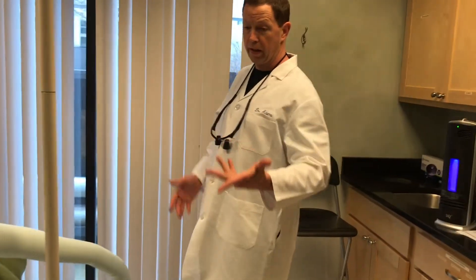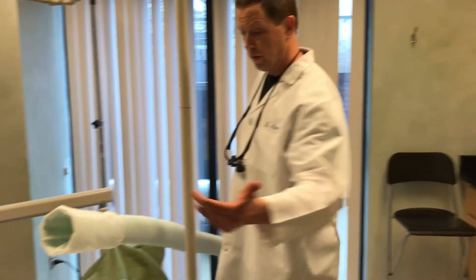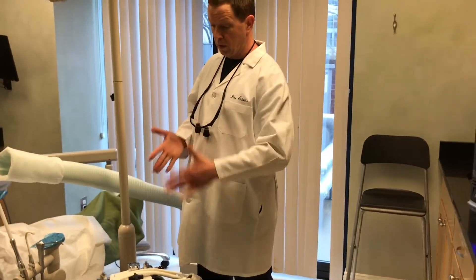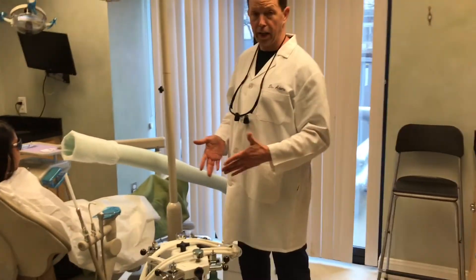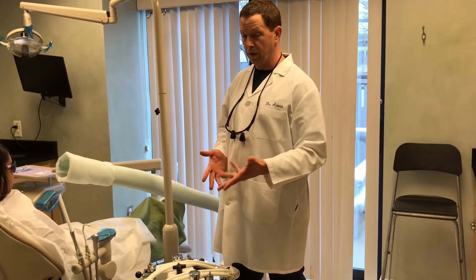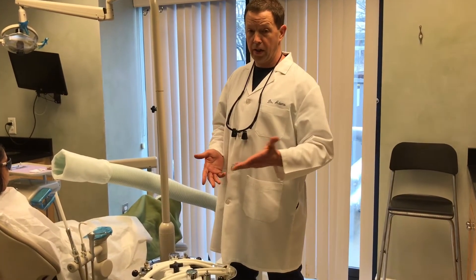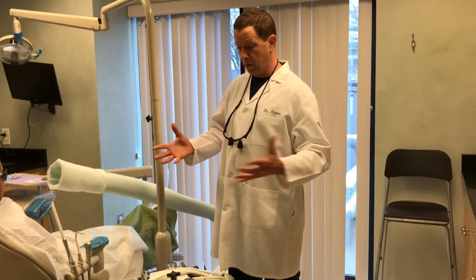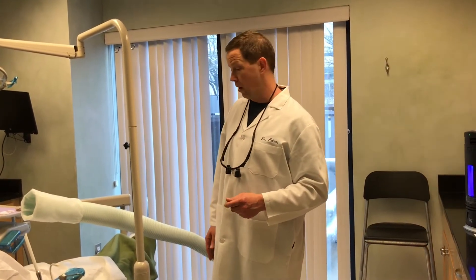We also have one other thing that's great for the environment. When we suction the filling particles out of the patient's mouth, everything goes down the drain and into the public water system. We have what's called an amalgam separator, which captures the particles. We have this filter that gets replaced every year, and that way we're not dumping mercury and other materials into the city water.